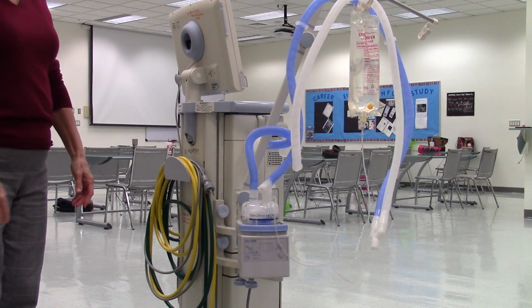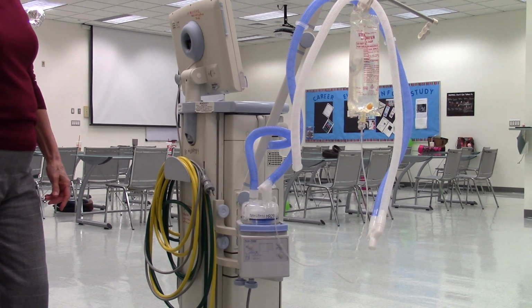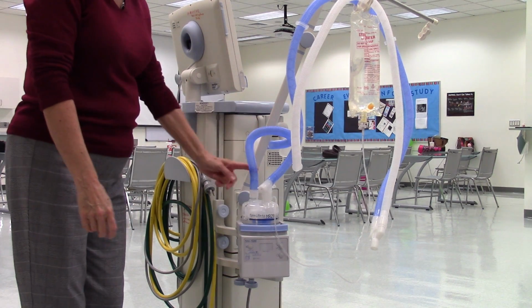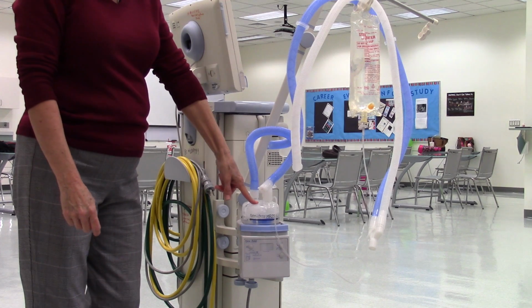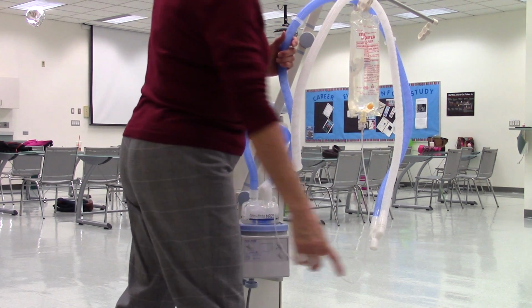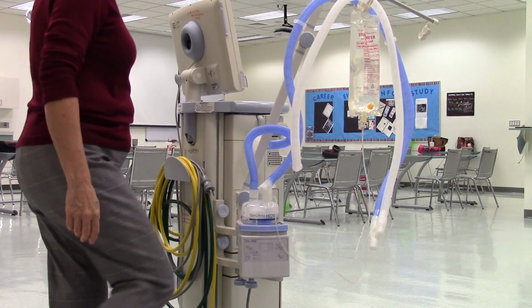Then it asks, explain how air flows through the circuit beginning with the ventilator and inspiratory port. Okay, so gas will come out of the ventilator. It'll travel through the tubing and go to the humidifier. It'll pick up the heat and moisture, then it'll travel to the patient. When the patient exhales, it'll come out the expiratory tubing and go inside the ventilator.